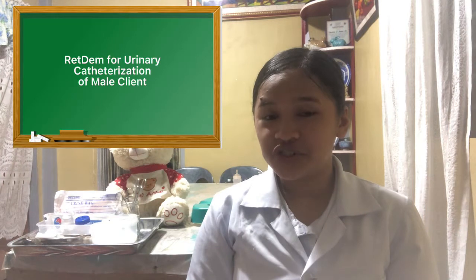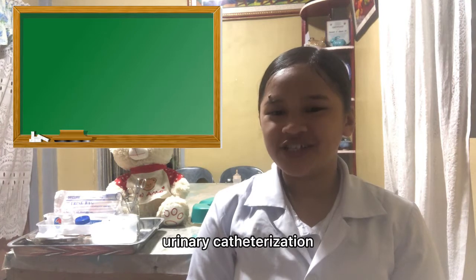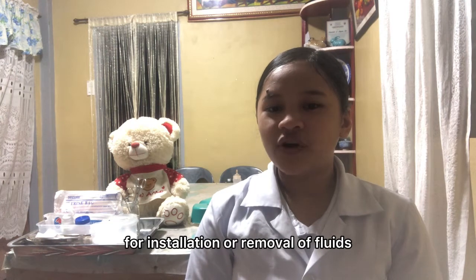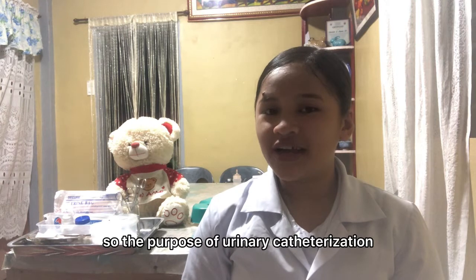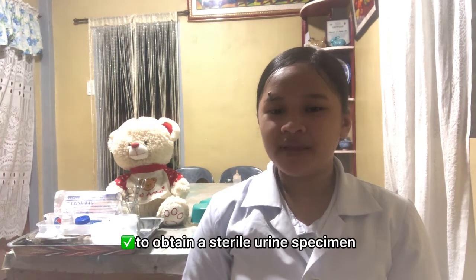Hi, I am Crystal Jean Elaces, and for this video, I'll be doing the return demonstration for urinary catheterization of a male client. Urinary catheterization is the introduction of a urinary catheter through the urethra into the bladder for installation or removal of fluids.